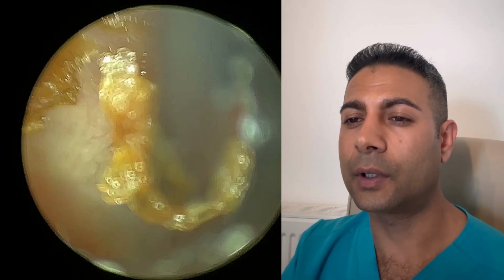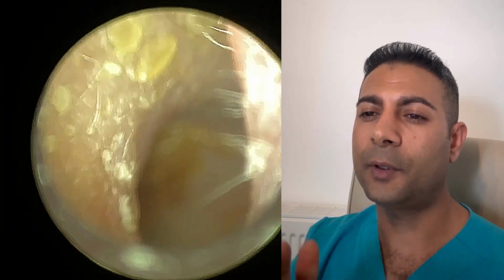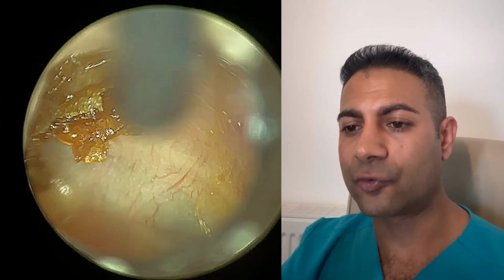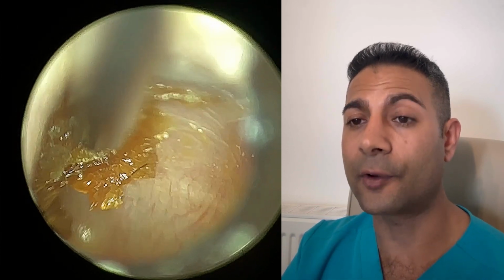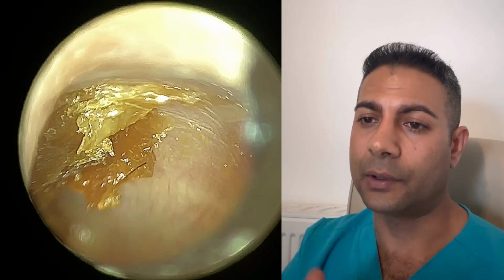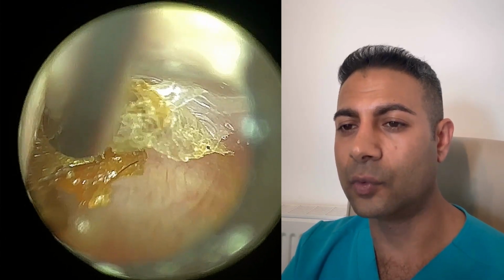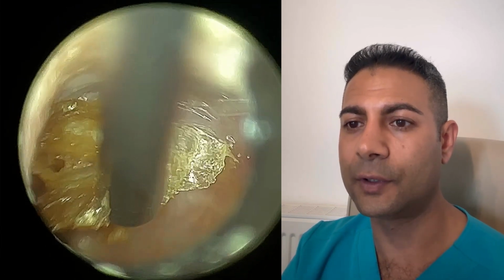So I've just gone to the back part of the eardrum. And this probably gives you a good idea of how narrow the ear canal is. I'm having to use the speculum to really dilate it. A bit later on, I'm also going to revert to the smaller size speculum. The speculum size that you're seeing here is our medium size speculum, which was fine. But when I'm really working in that anterior recess, I just wanted to be able to enter the ear canal a bit further. So I used a smaller size speculum, which has an outer diameter of 3.5 millimeters.